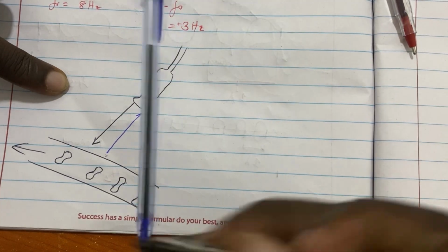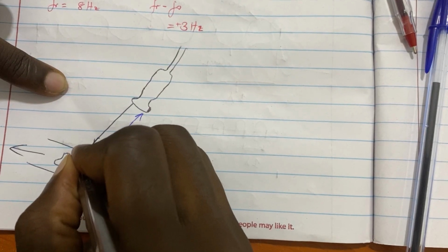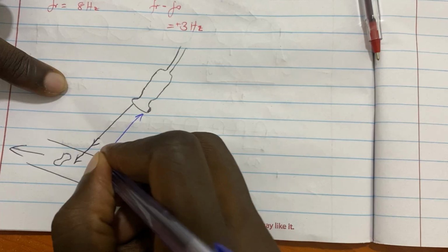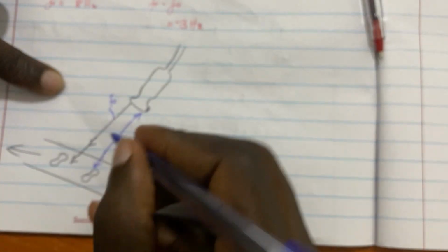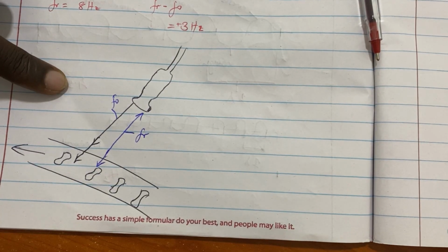When this ultrasound hits the boundary, it gets reflected. This is F naught transmitted, and then this one is FR reflected.